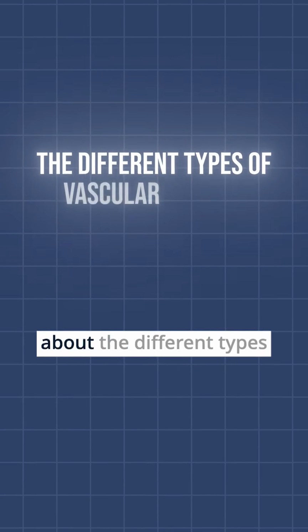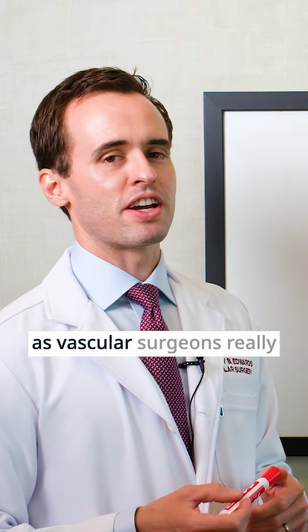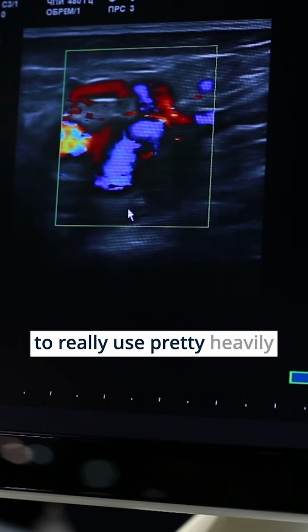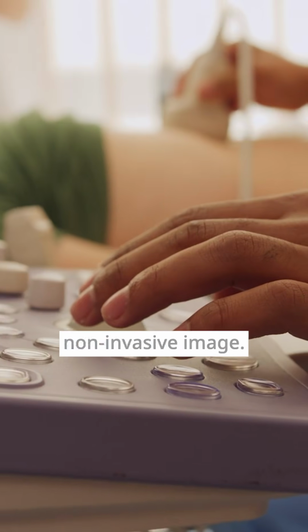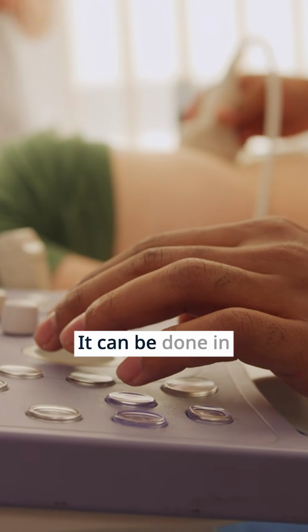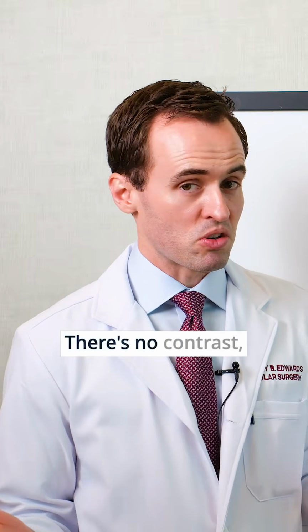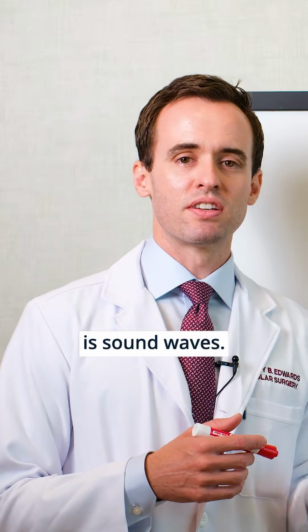Today we're going to talk about the different types of vascular imaging. One type of imaging that we as vascular surgeons really depend on and have come to use pretty heavily in our practice is ultrasound. So ultrasound is a non-invasive image. It can be done in the office setting. There's no radiation. There's no contrast, and what we're using is sound waves to make a picture.